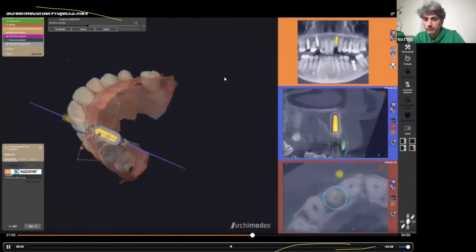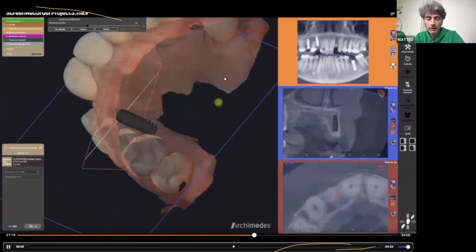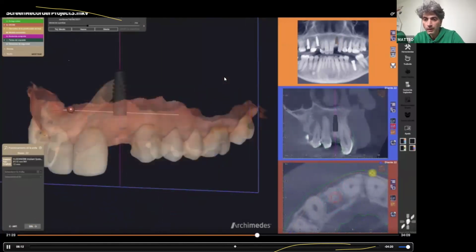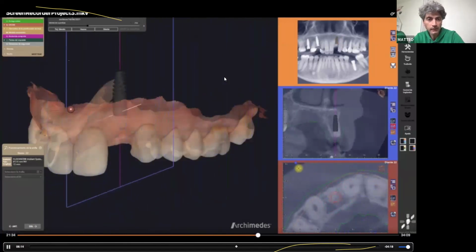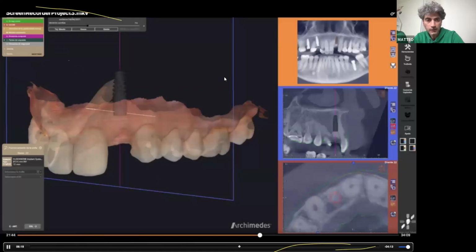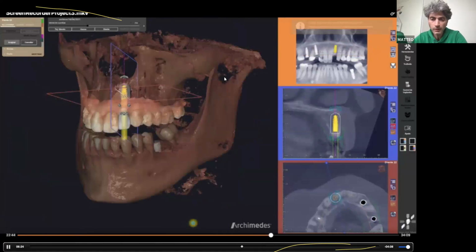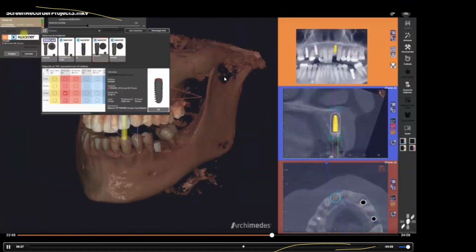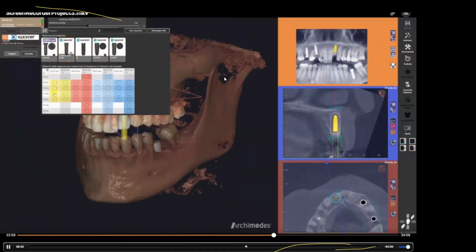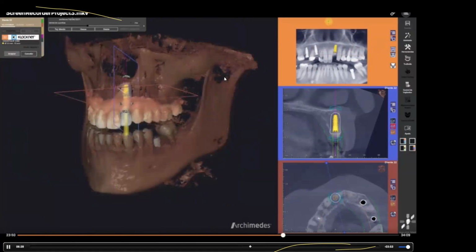Okay, so the implant is emerging on the incision on the cingulum of the lateral incisors, not touching the adjacent roots, and we have enough bone to use this implant. Итак, мы видим с вами, что имплантат мы спланировали таким образом, что выход шахты будет у нас идти палатинально, он не касается соседних зубов. В общем, все планирование проведено корректно.